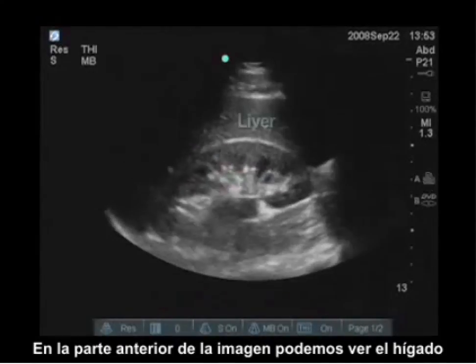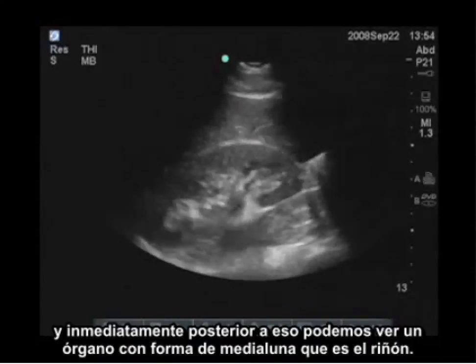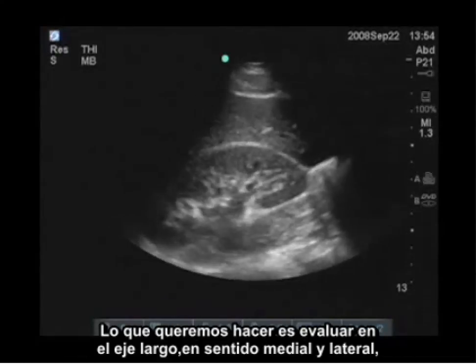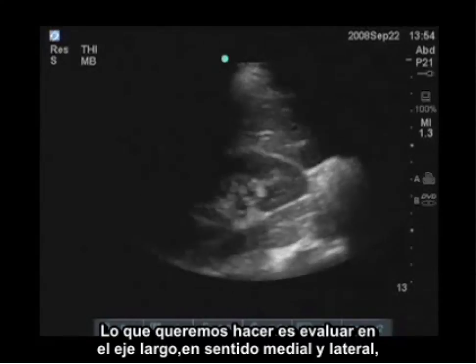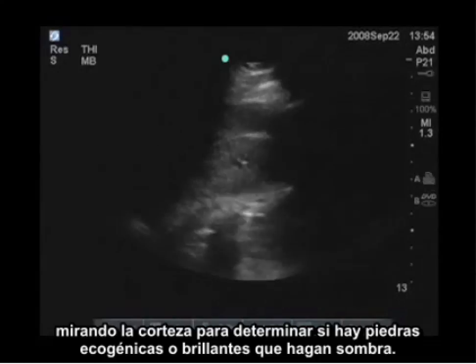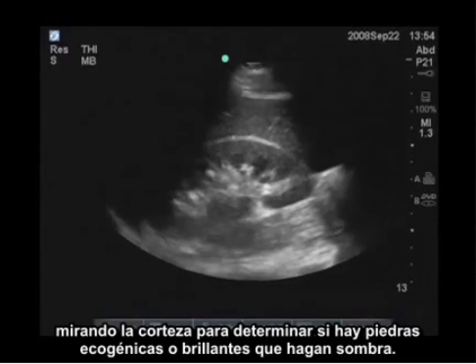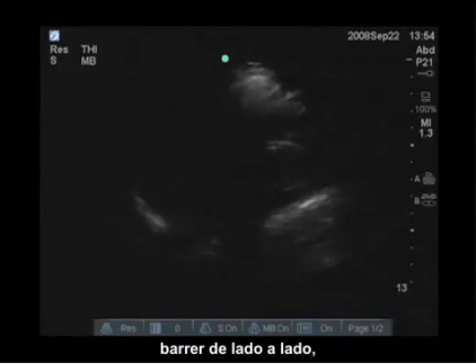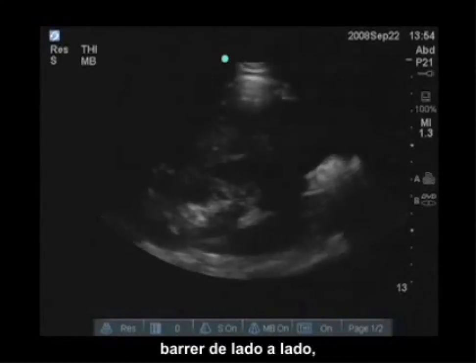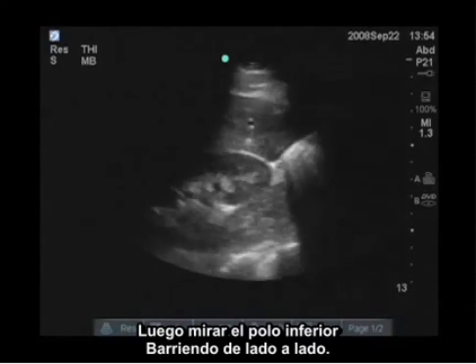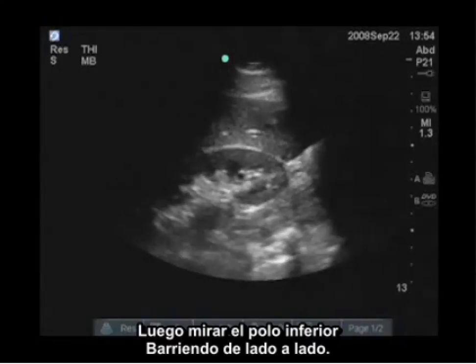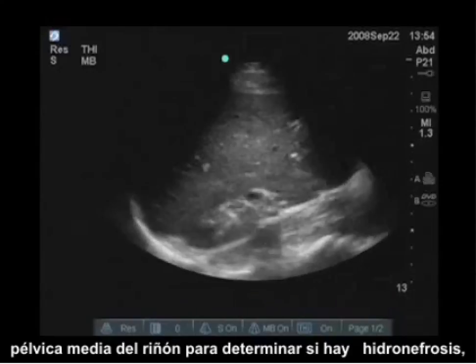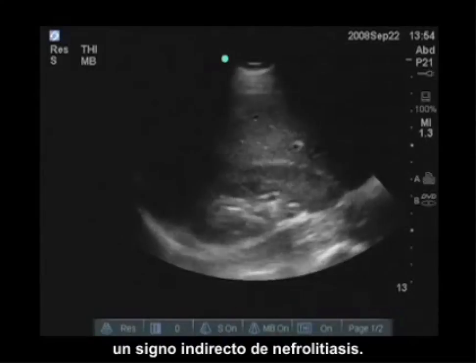In the anterior aspect of the image, you see the liver. Immediately posterior to that, you see a crescent-shaped organ, which is the kidney. I want to evaluate in a long view, sweeping medially and laterally, looking at the cortex to determine if there are any echogenic or bright shadowing stones. I can evaluate the superior pole, sweep from side to side, and look at the inferior pole. Then look in the mid-pelvis area of the kidney to determine if there's hydronephrosis, an indirect sign of nephrolithiasis.